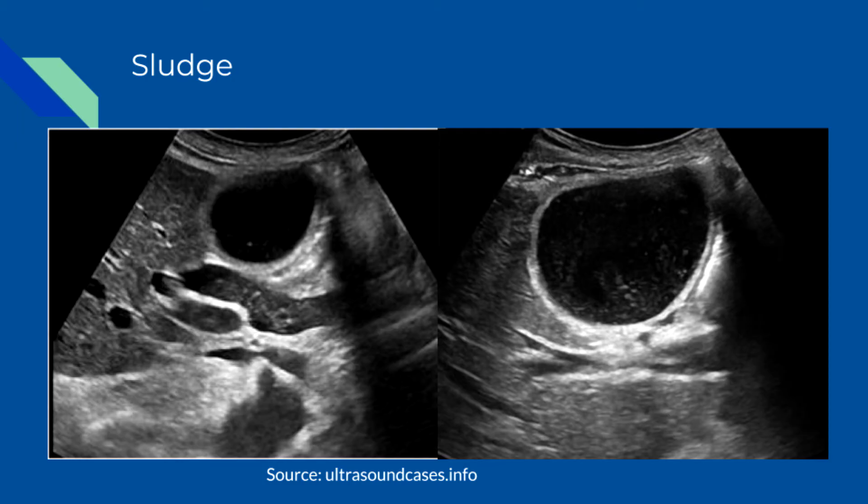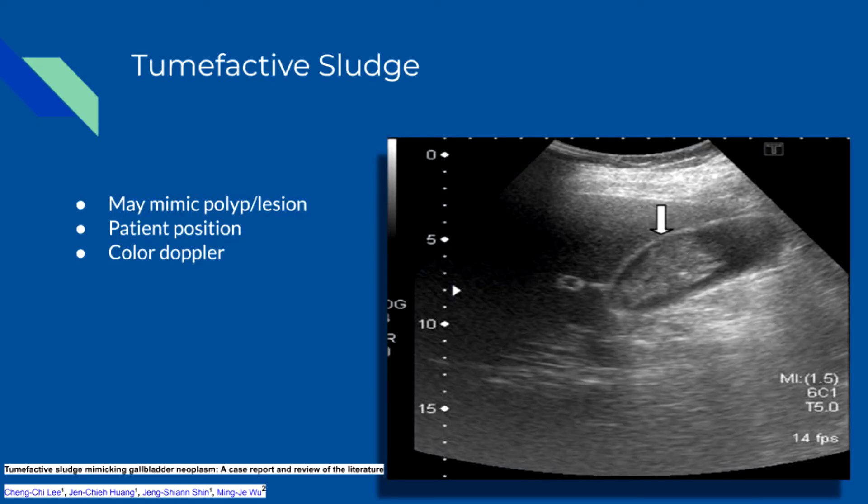Sludge may aggregate into clumps, which may simulate masses or polyps. This is known as tumefactive sludge. In these cases, patient position won't change it, but you can add color Doppler and show that there's no blood flow within the sludge.